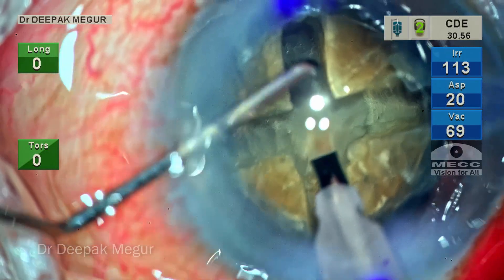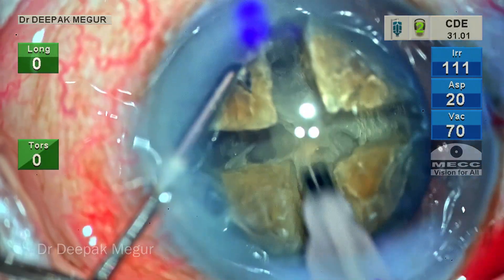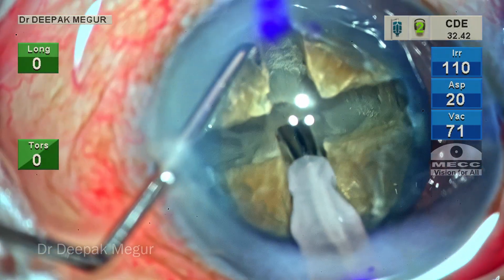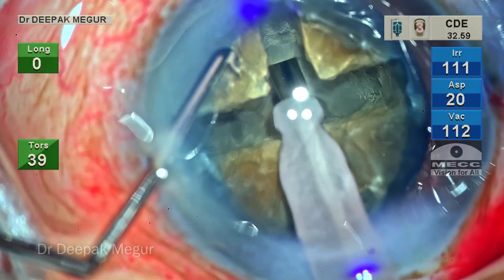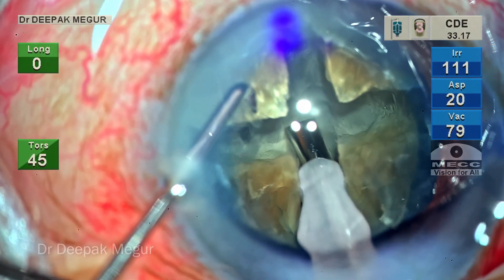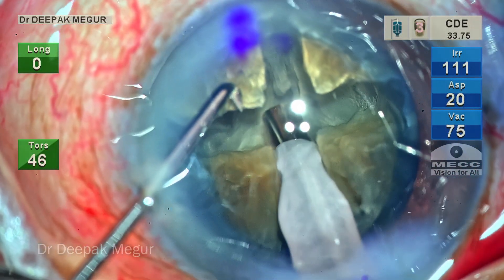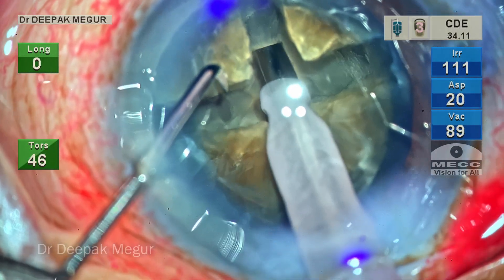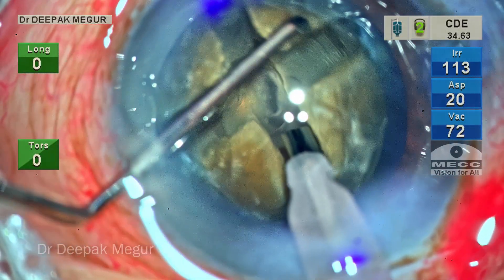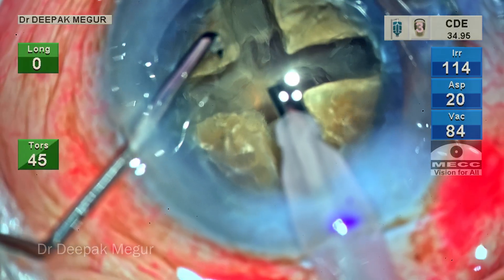When you no longer see those horizontal striations and the color becomes a little bit darker, this suggests we are at almost 90% depth. As sculpting continues deeper, the yellowish tinge disappears and an underlying gray or black area becomes visible. The horizontal striations of lens fibers have all disappeared. This is an indirect sign that we have gone beyond 85 to 90% of the lens thickness.